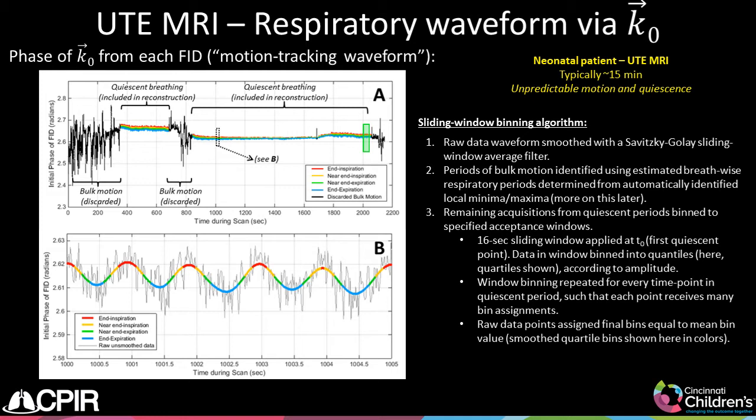This gating scheme requires no additional data beyond that needed to produce ungated images, and it maintains a high temporal resolution equal to that of the scan repetition time, 5 milliseconds, both before and after filtering. Furthermore, a true steady state is maintained.